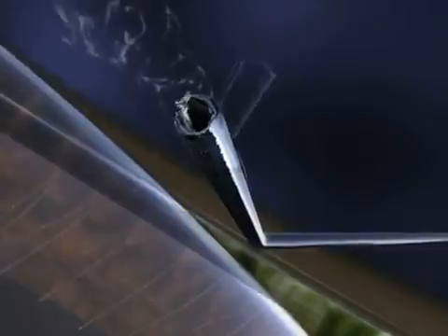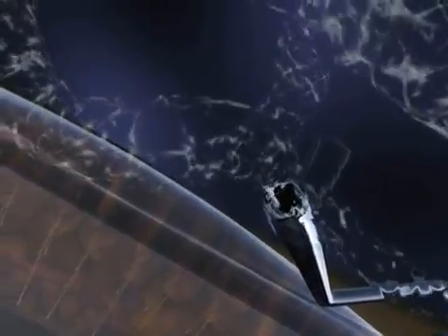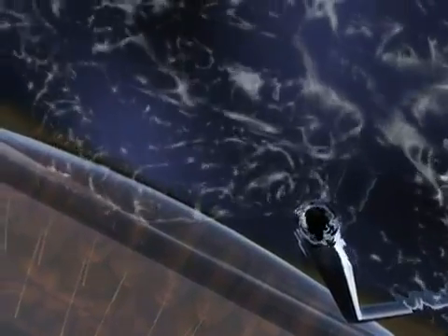Next, a gel-like substance will be placed inside your eye to protect the eye during lens placement. This gel will be removed at the end of the procedure.